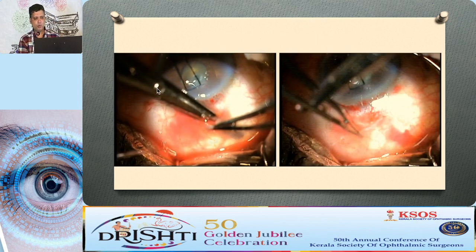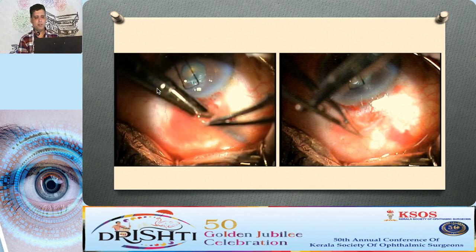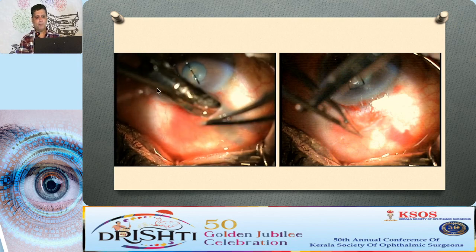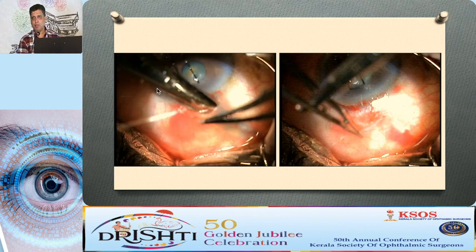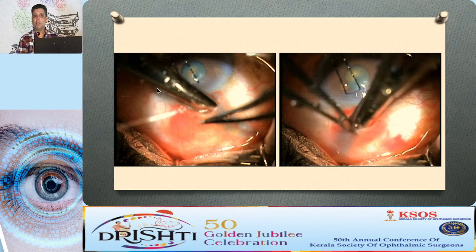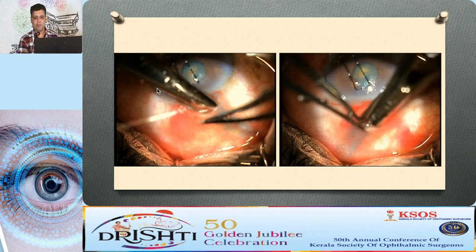Generally, I use non-tooth forceps to hold the conjunctiva, and as I dissect the subtenon space I make sure that wide pockets are created on either side. This particular step of dissection is very important, not only in exposing the area of surgical dissection, but also in subsequent conjunctival closure at the end of the surgery. A good conjunctival closure basically begins with a good conjunctival dissection.